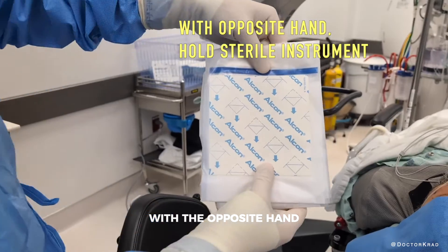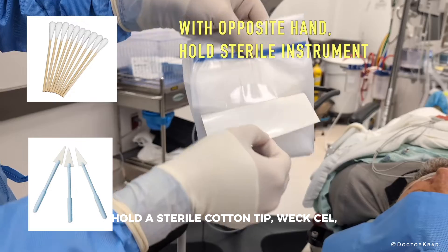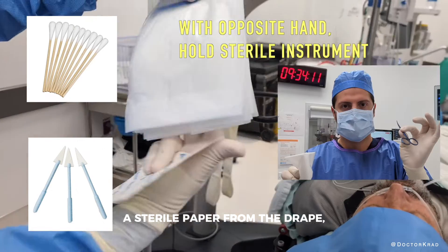With the opposite hand, hold a sterile cotton tip, Weck-Cel, a sterile paper from the drape, or draping scissors.